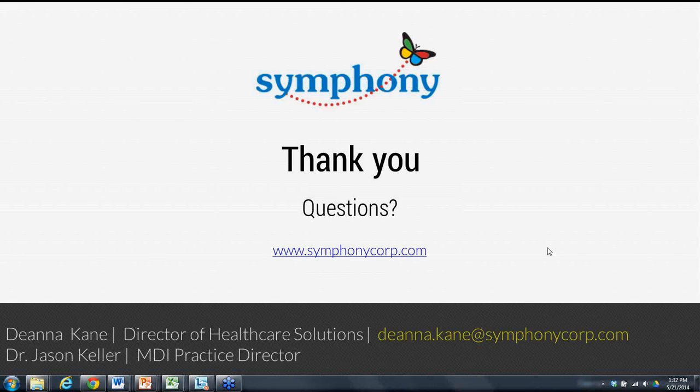That should probably be the number one thing that you're looking at, with cost being a close second. And then there are some additional factors like ease of use. How much clinician involvement does it require, and supportability? What does it take to support the product? I think those are really the big questions to ask yourself when you're looking at a vendor.